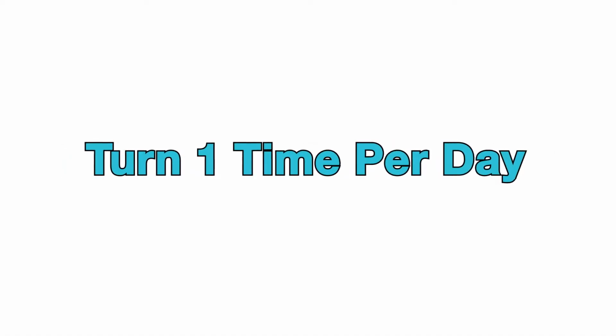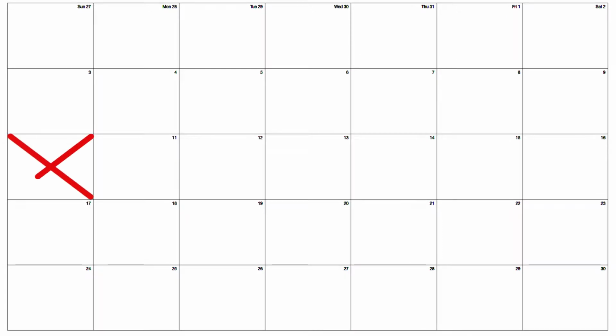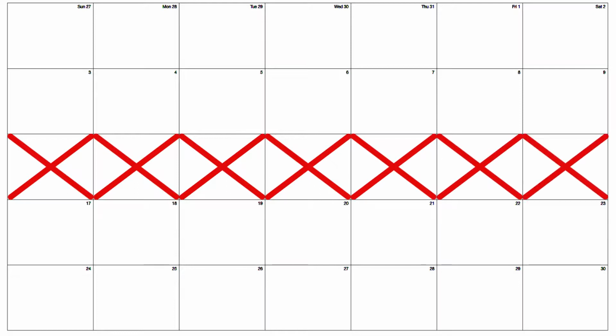Turning should be completed 1 time per day. It does not matter what time of day you complete your turn, and it does not matter if the turns are 12 or 24 hours apart. The important thing is that you complete the turn. I often suggest that you mark on the calendar when a turn is completed, so that you will know what days you have completed a turn and how many turns you have completed.